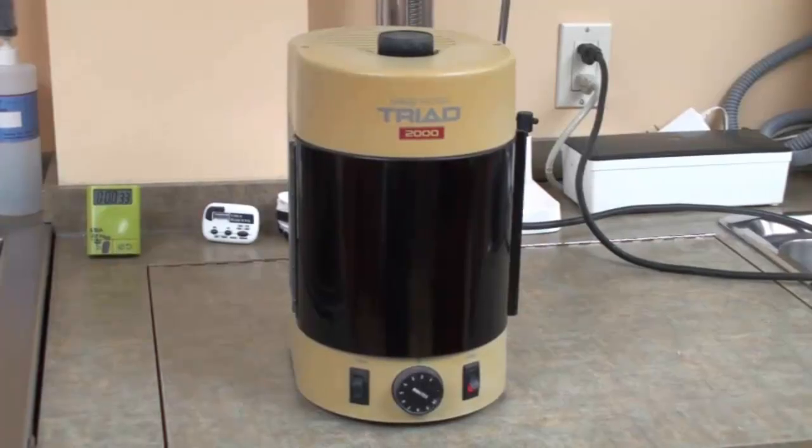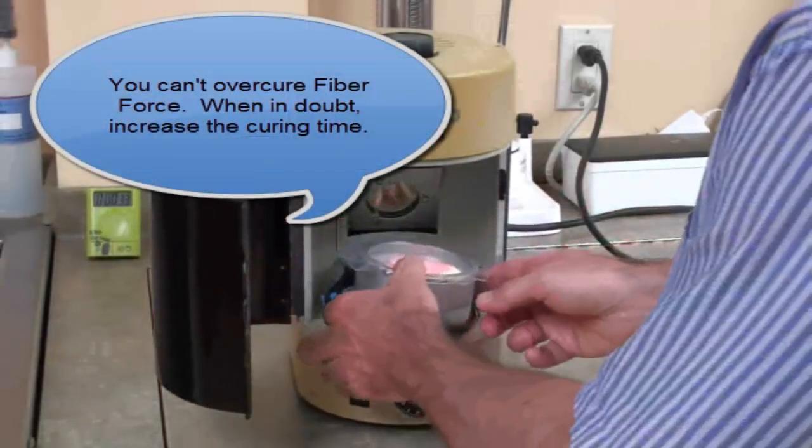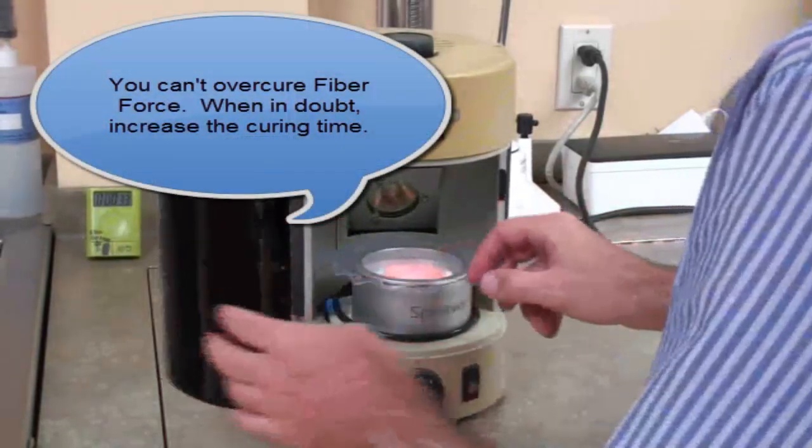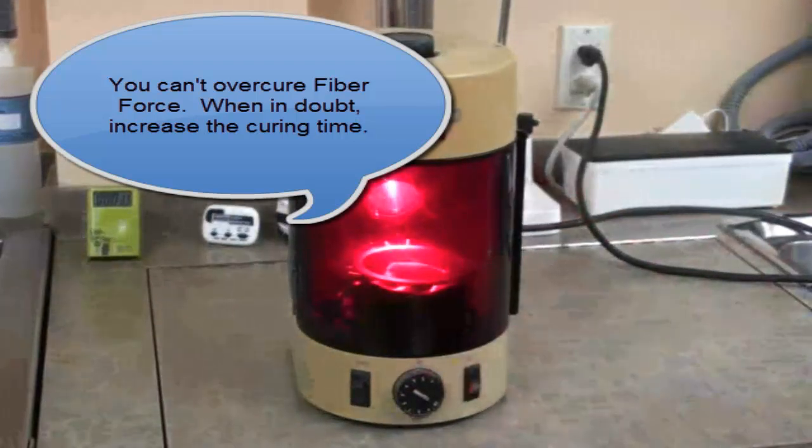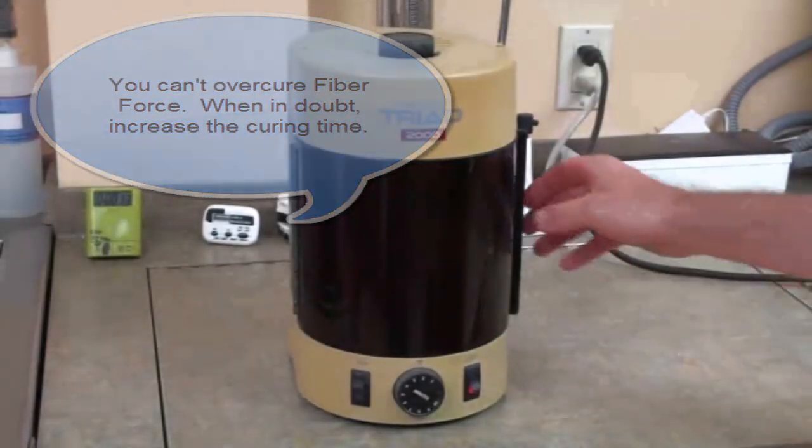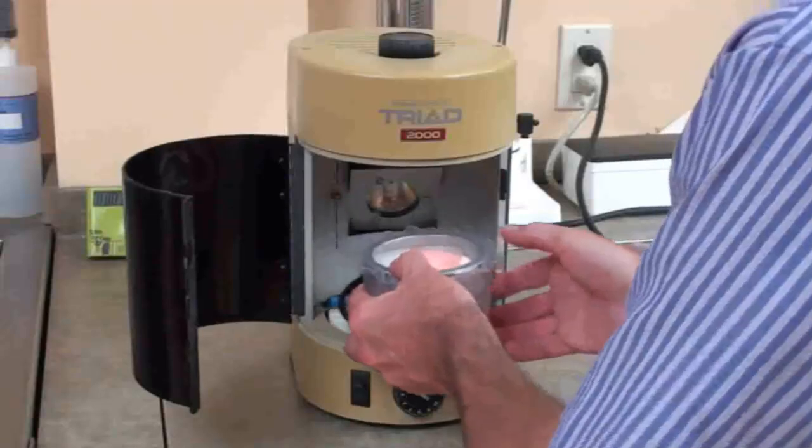The splint vac unit is then placed inside a light curing unit, such as a triad, to polymerize the mesh framework. As long as the splint vac fits inside, any light curing unit will work. The stronger the unit, the less curing time is required. Once the appropriate time has passed, the splint vac is removed.